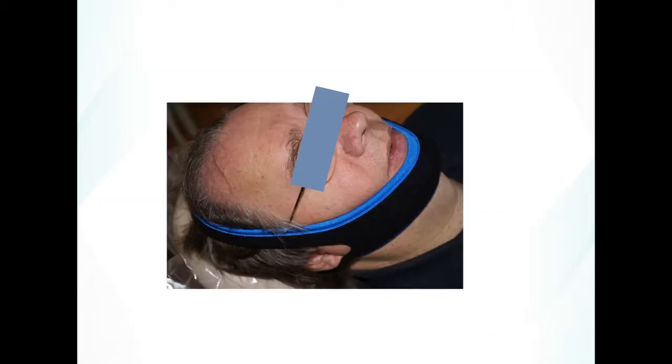This guy dislikes his picture in every presentation I do. He wears this thing, which is from Australia. It's like a neoprene strap. It's a great chin strap, by the way. It's very comfortable. You can get them on the internet. Instead of the ones that they tie around, it actually works pretty well for people with CPAP who want to keep their mouth closed. He wears this, CPAP, and an oral appliance.